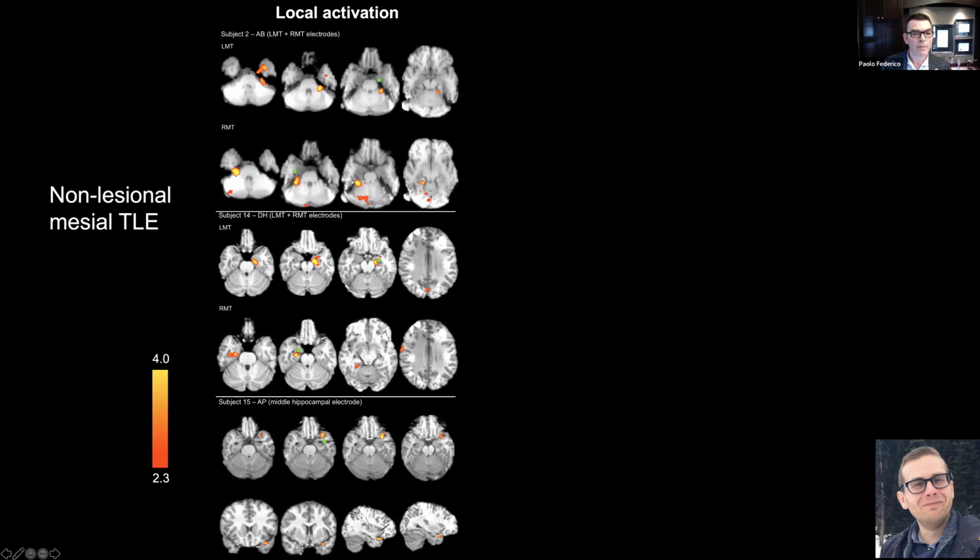This is a patient with independent epileptiform discharges and seizure onset zones. Another one with independent epileptiform discharges and unilateral discharges. This group of patients, we now got 5 like this. I'm just showing you 3.